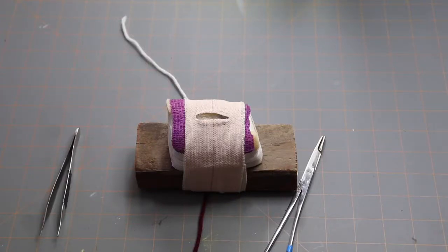Hi everyone, welcome to suturing. I'm going to start off with showing you how to hold your instruments, then how to do the throws of the suture, and after that I'll show you how to place an actual suture.